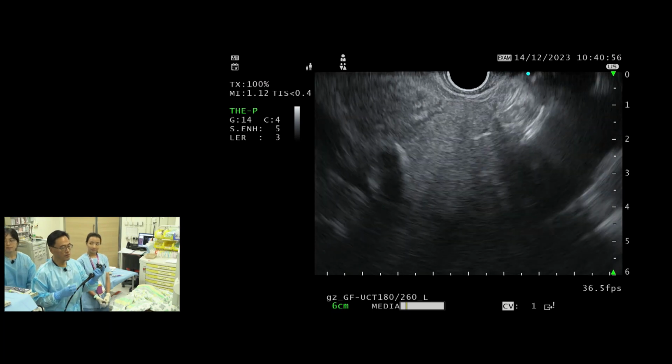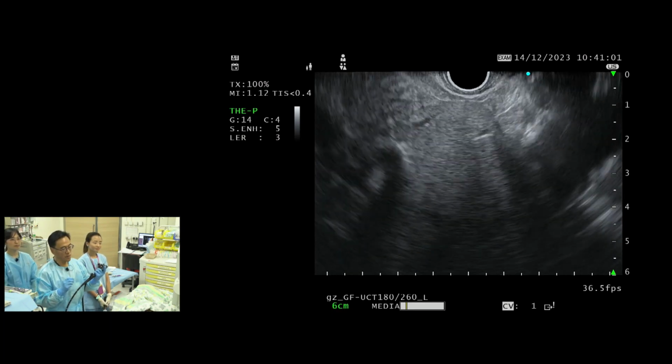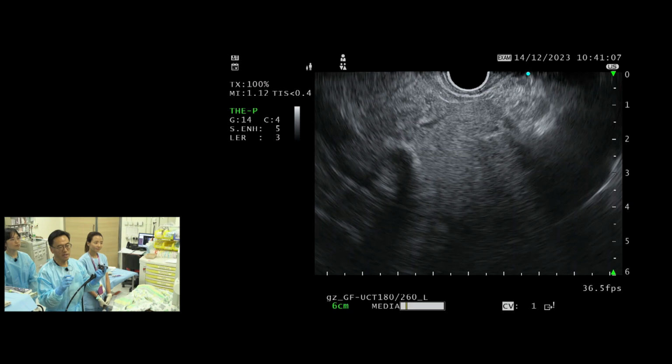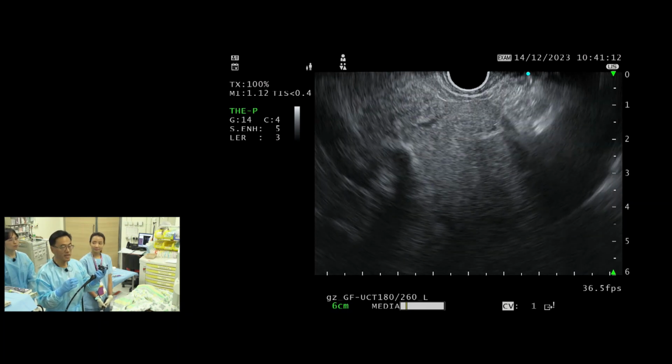Yeah, so these are all really important questions. The measurement of the pressure within the main portal vein and the left or the right portal vein, if it's reasonably close to the takeoff, within 2 to 3 centimeters, has the same pressure.